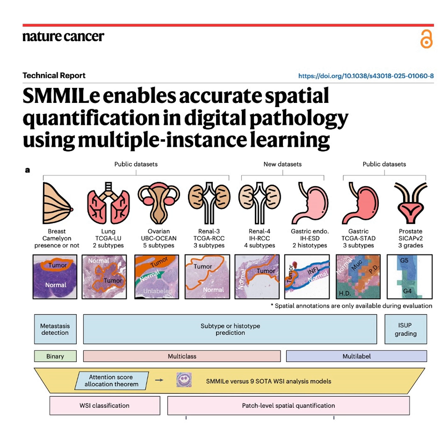And it trains this via a self-training network using pseudo-labels, right? Yes. It takes the top percentage of its own highest confidence predictions and the bottom percentage of its most confident negative predictions and uses them as a temporary answer key to teach its own next layer. This allows SMMILe to set a unified decision boundary across entirely different patients, smoothing out the map.